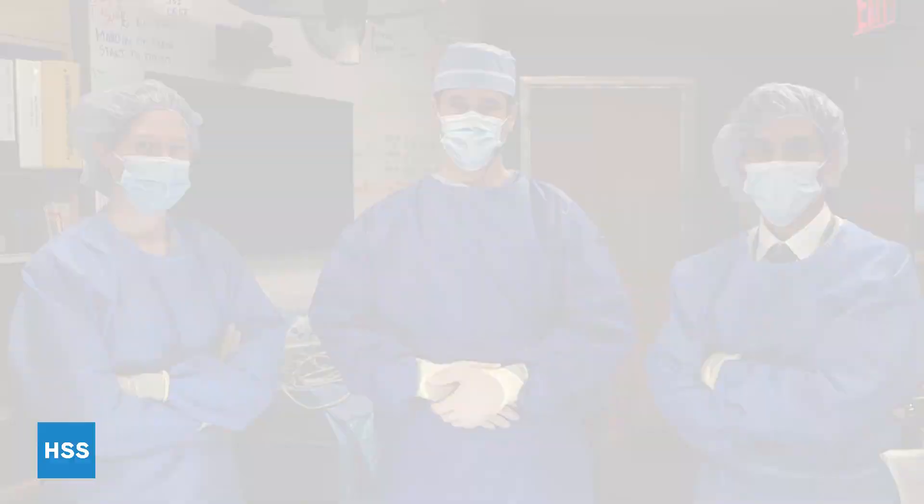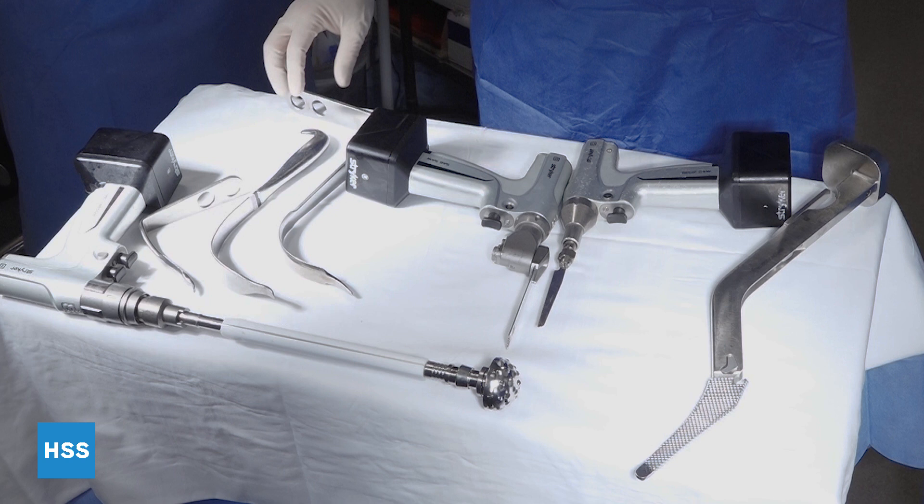Hi, I'm Jason Blevins. I'm here with Cindy Kallenberg and Ajay Premkumar. We're going to go over some basics on instruments for hip replacement, starting with broaches, reamers, and some of the retractors and saws that we commonly use.